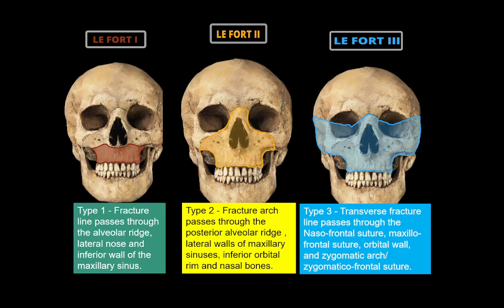I showed these images to you just to give you an idea that when we are doing any imaging, there are so many differentials in our mind, and we have to be careful in evaluation, and we should have some checklist and some points to narrow our differentials, but ultimately we need a very good history of the patient. Unless we are collaborating or coordinating with the physician, sometimes we either overcall the disease or miss the findings. Then there are 3 types of facial fractures.